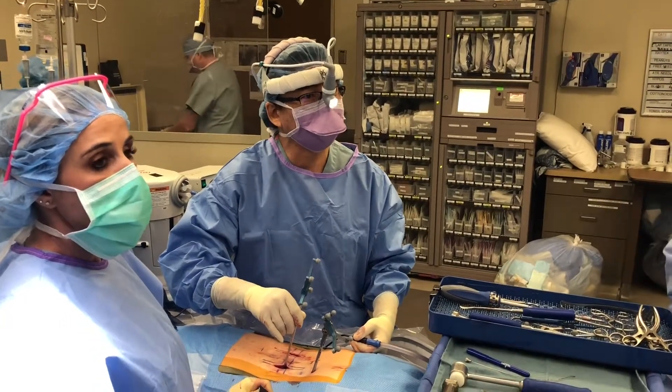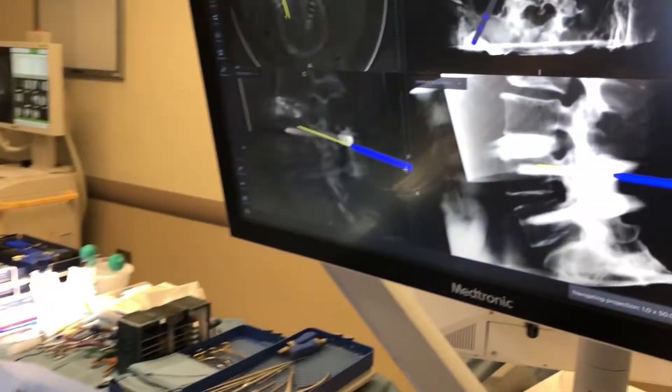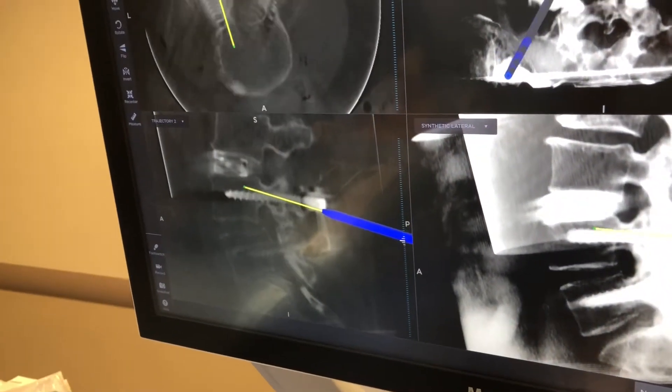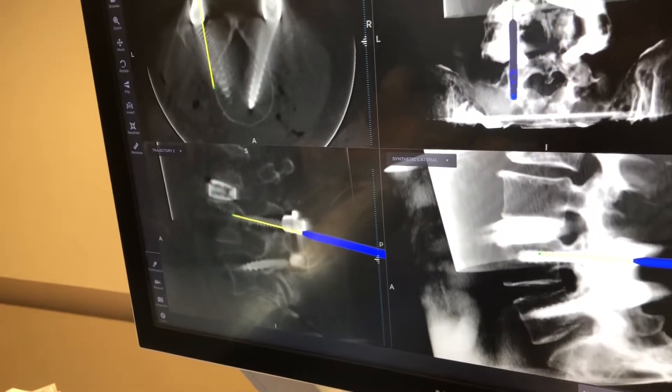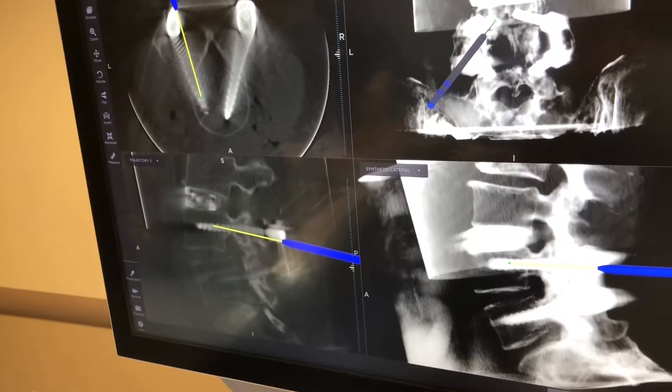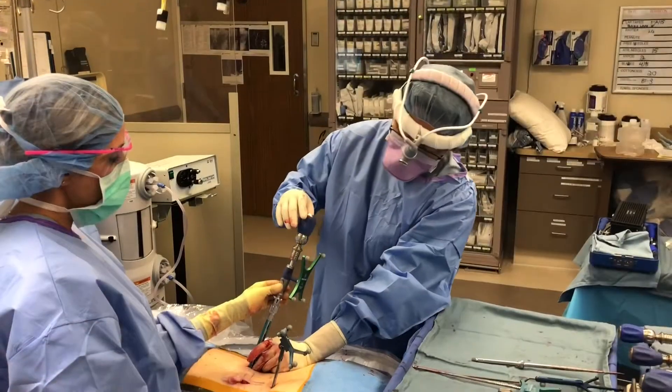This is the examination of the left side. I know you have a little bit of left-sided pain too, but again you can see I'm scrolling back and forth, I can see everything, and I do not see that bone spur anymore. I think the indirect decompression is going to be the way to go.